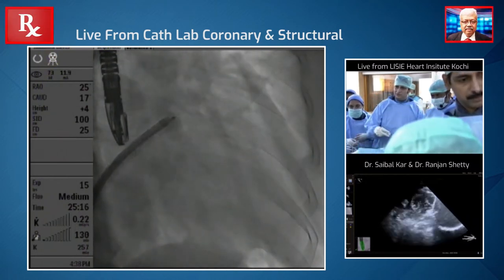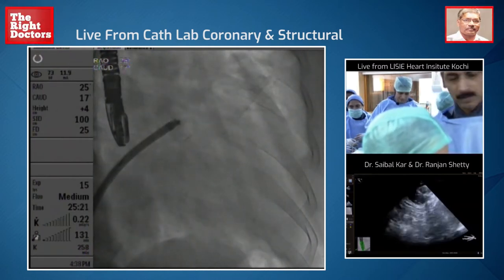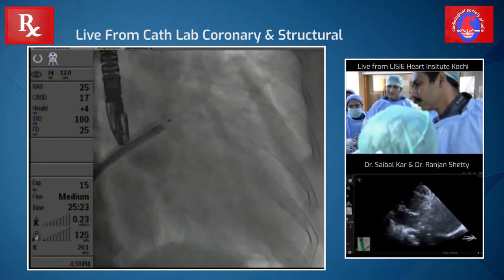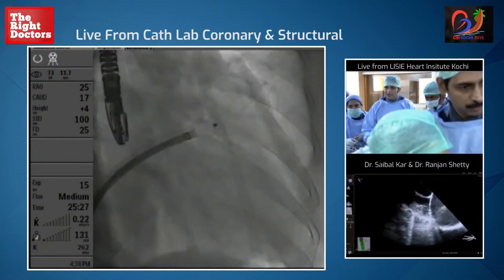Can you just withdraw it slightly and push it? It's very deep, it's come out — see? Okay, so it came out, we are out. So we have to make a small blob again and then go in. We're going to see if we can get in like this, and actually we managed to get in.